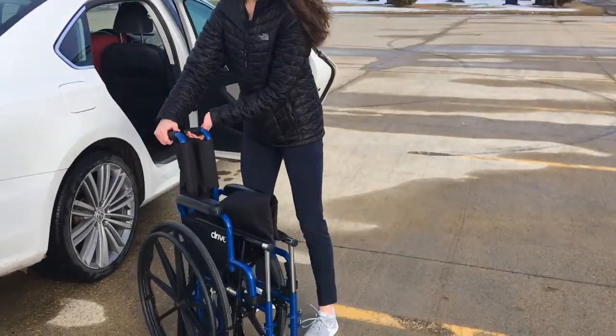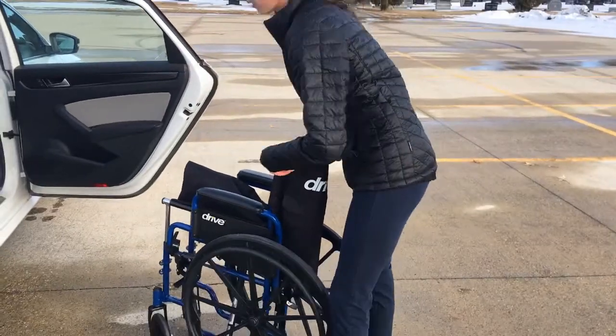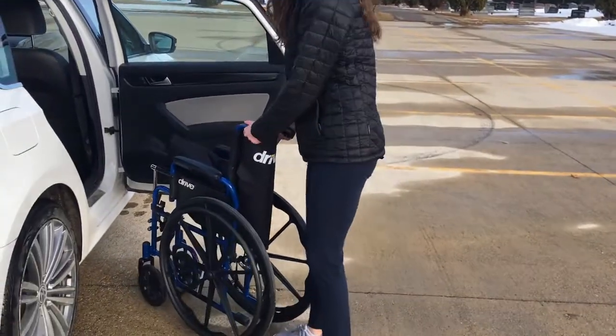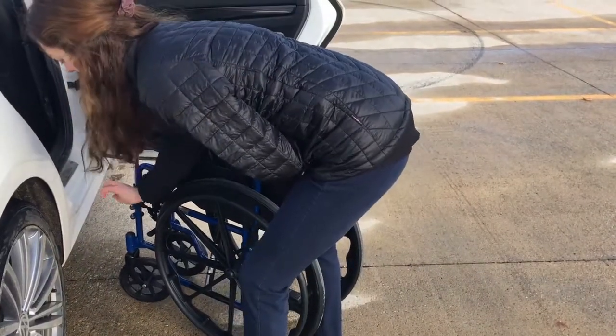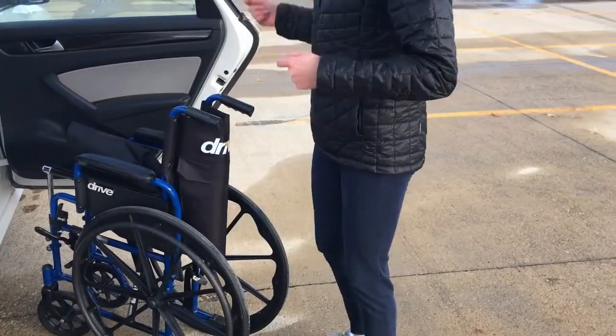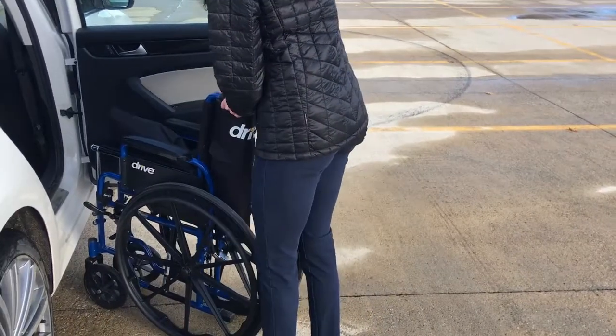Then we're going to wheel the wheelchair close to the car. A crucial step is to put your brakes on, because if we grab the wheels we don't want the wheels to be moving on us. Get the wheelchair nice and close.